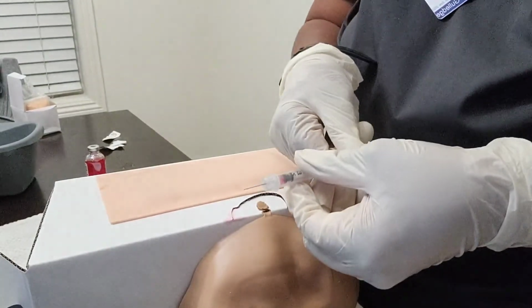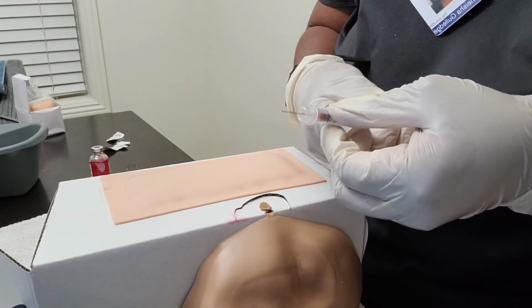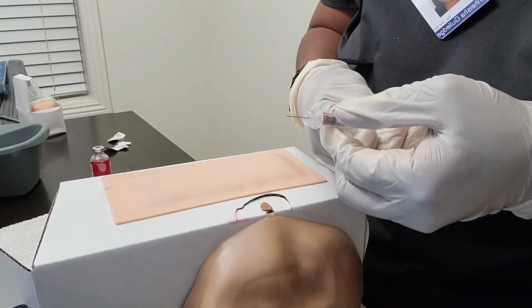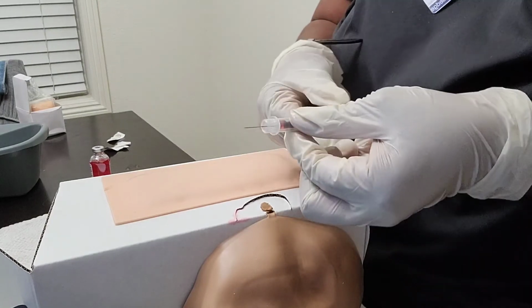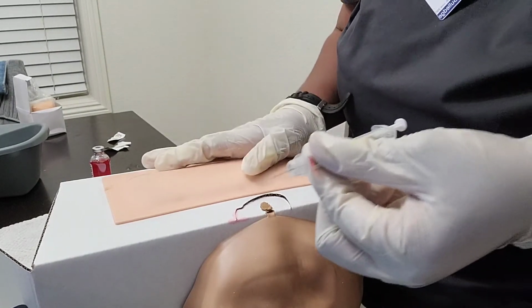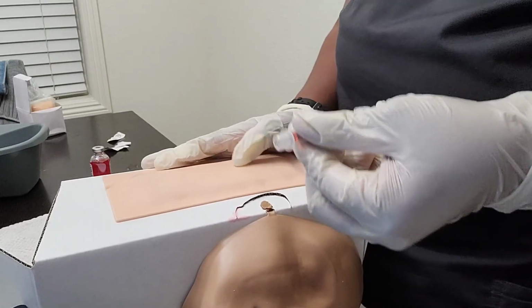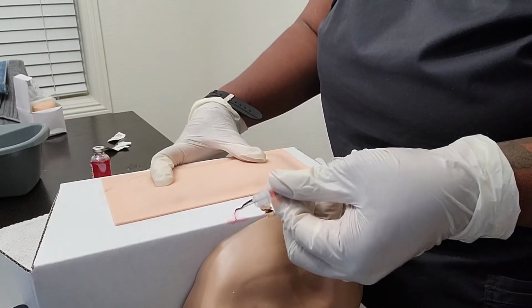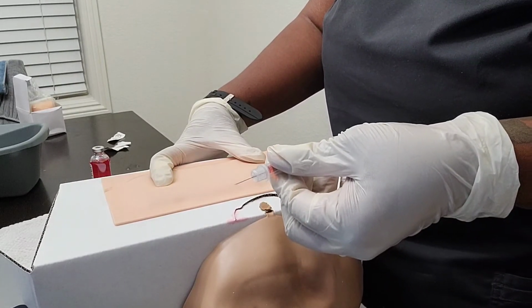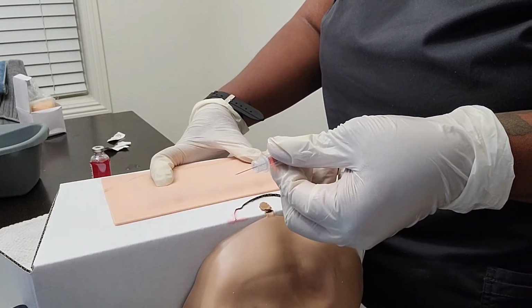So with my dominant hand, I want to make sure the bevel is facing up, and I'm holding it with my forefinger and my thumb, and then I'm stretching the skin with my non-dominant hand.